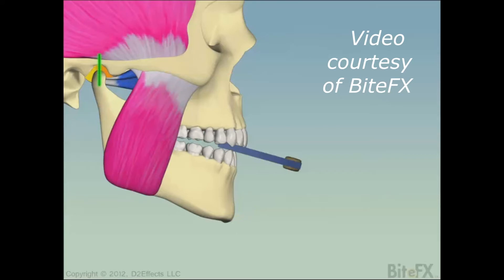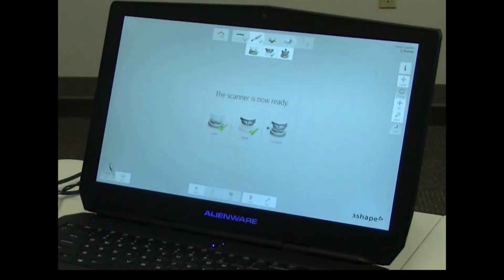It is at this point that you are ready to take your bite scan. Once you have created both arch scans, set your scanner to the correct setting to capture the bite position.